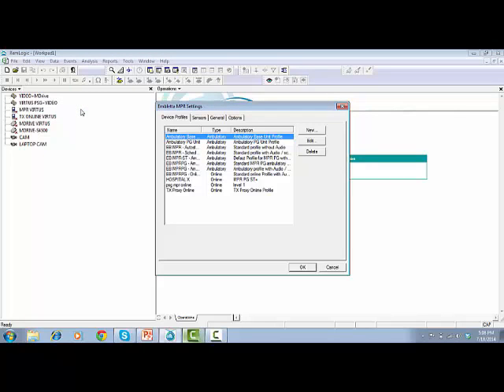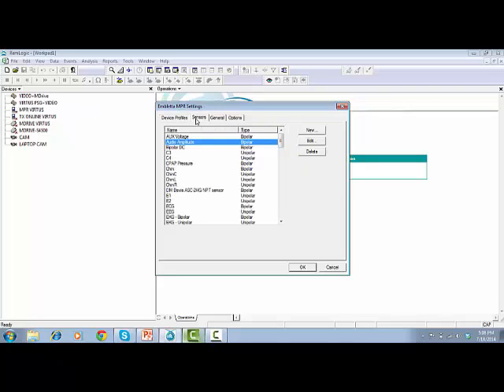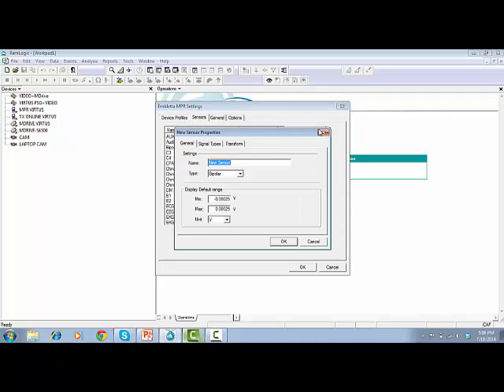Embletta MPR Settings window will pop up. Go to the tab Sensors and click on New. A new sensor properties window will pop up.